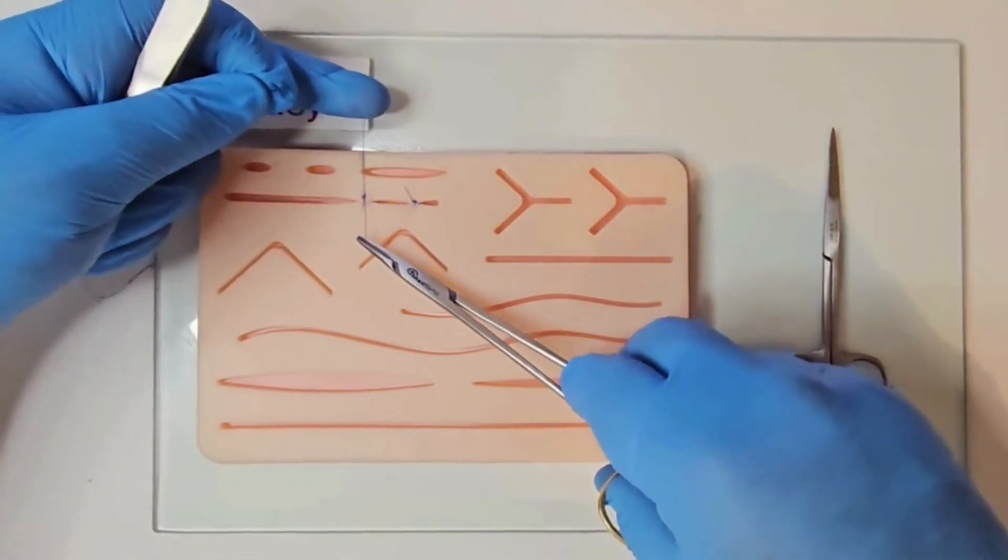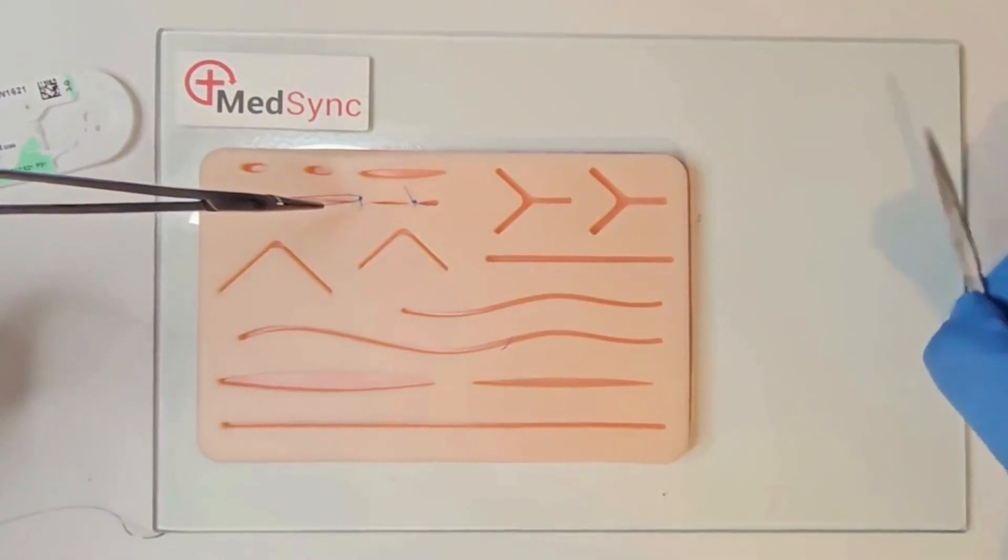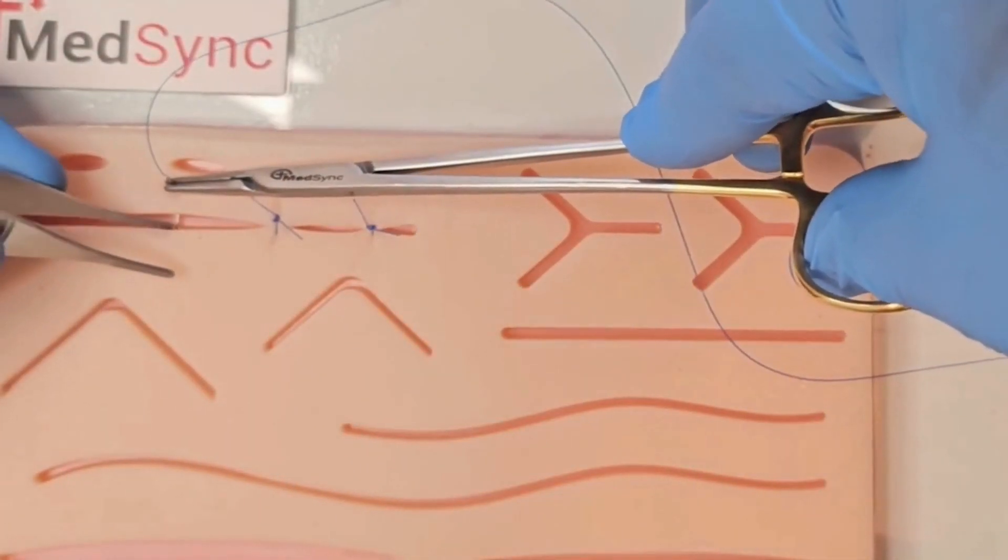The end point is the approximation of dermis to dermis, epidermis to epidermis. Now in closer detail.